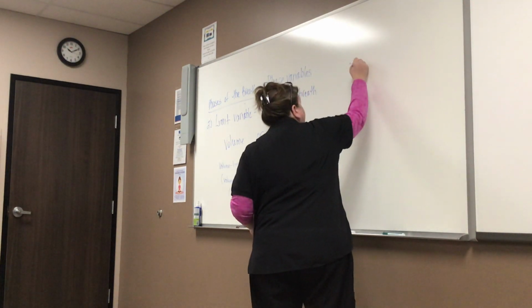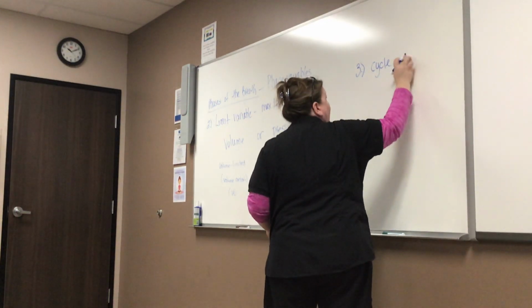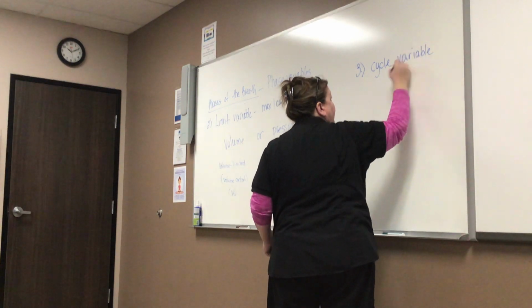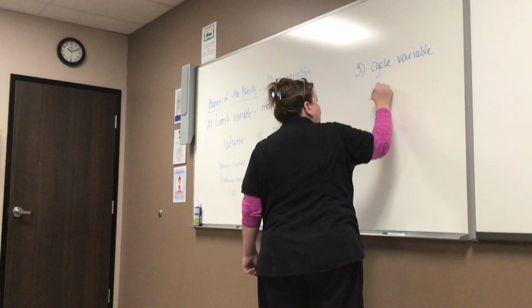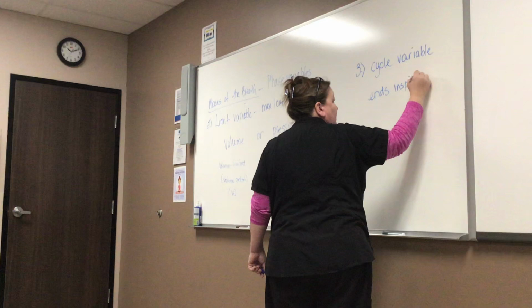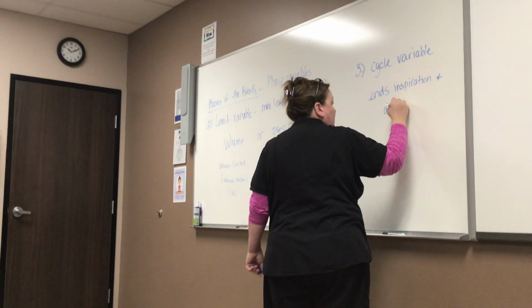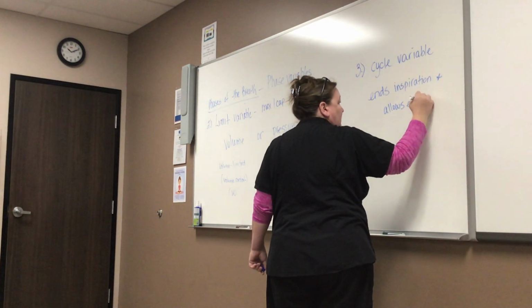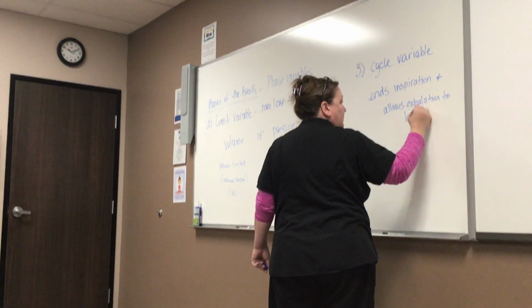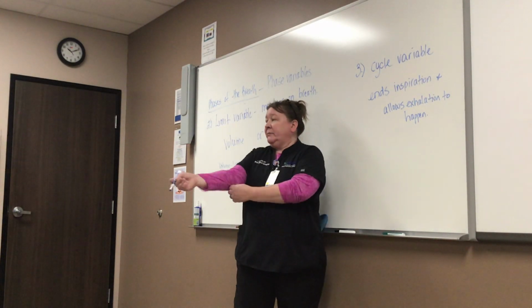Then number 3 is the cycle. And what does the cycle do? Terminates the breath. Yes, it ends the breath. Allows expiration to happen. So it ends inspiration, allows exhalation to happen.